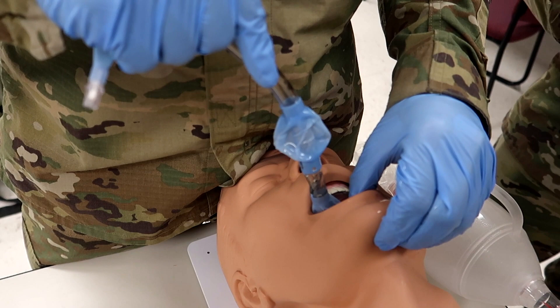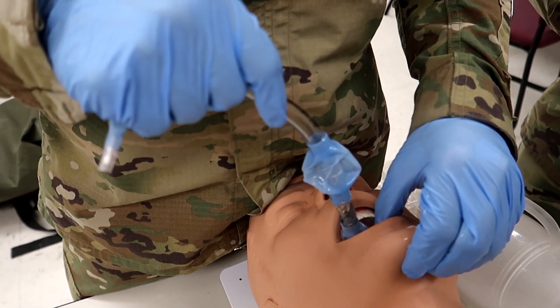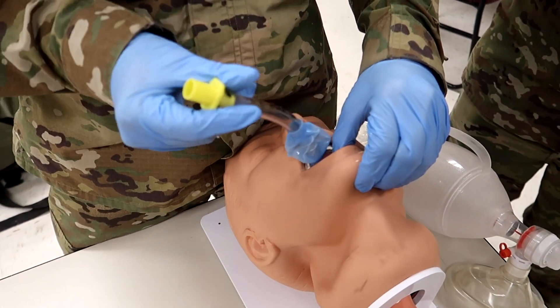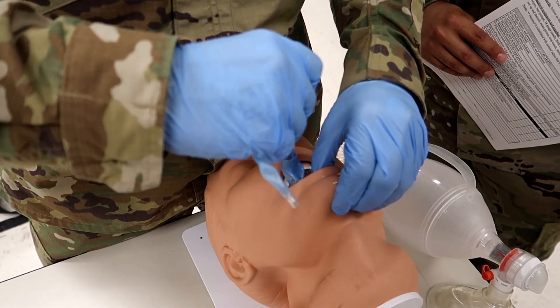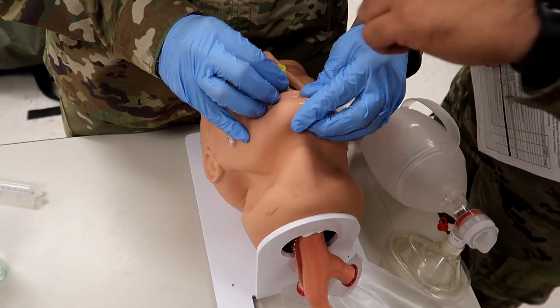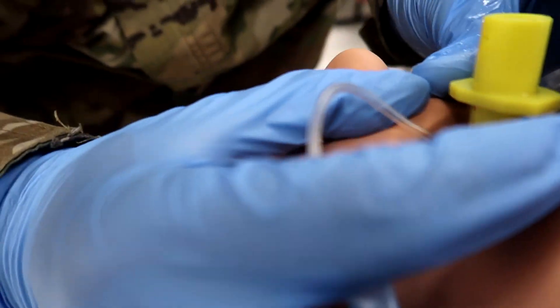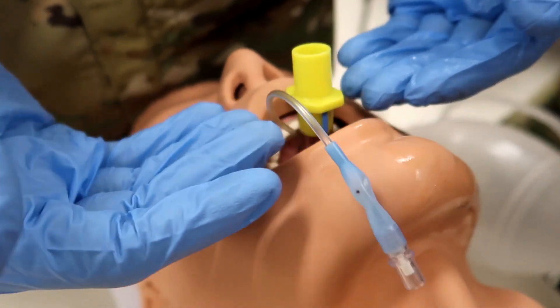Now that he's done that, he's going to advance the tube — as the tube passes the back of the tongue, rotate the tube back to the midline. So you can see he's going in at an angle, and as he passes, he's going down, twisting towards the midline. He's going to put that in all the way — all the way in is going to be pretty much where the lips purse, towards the connector.